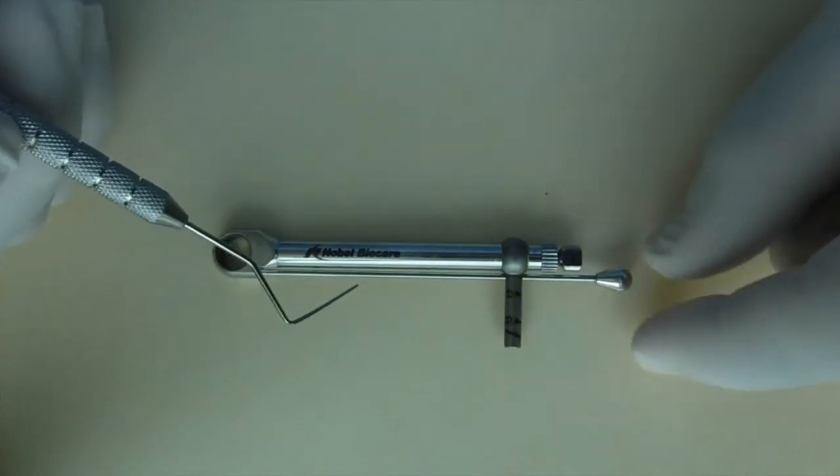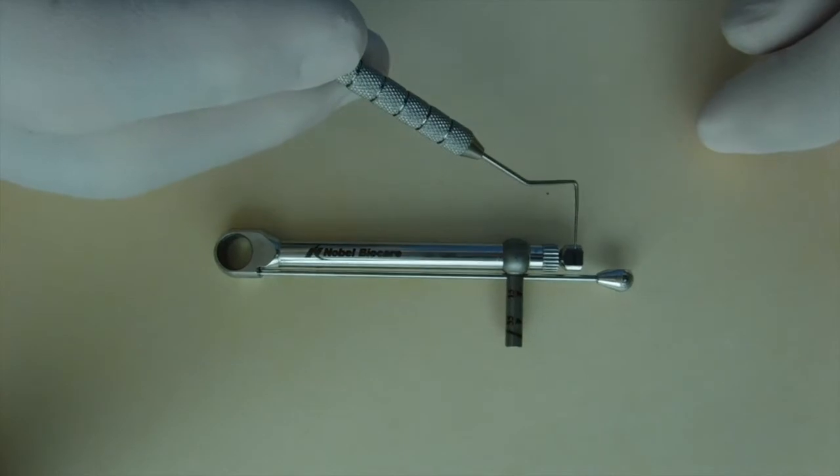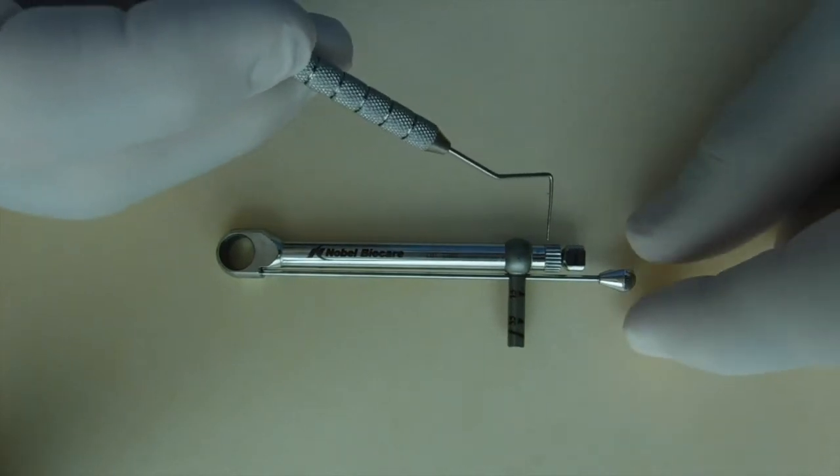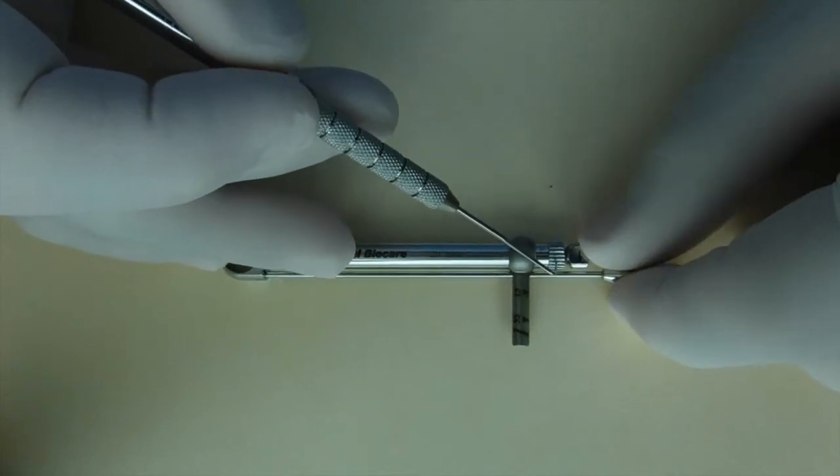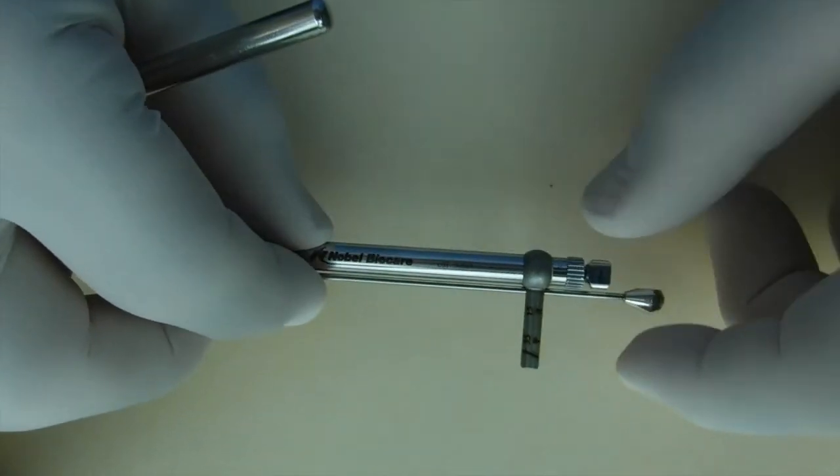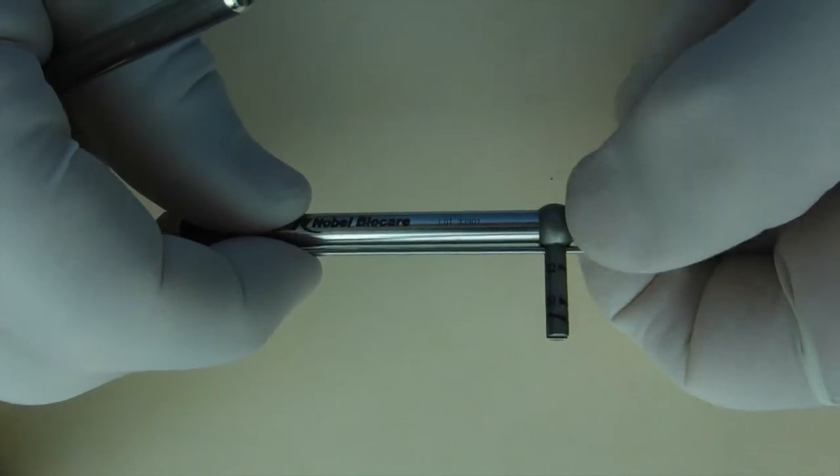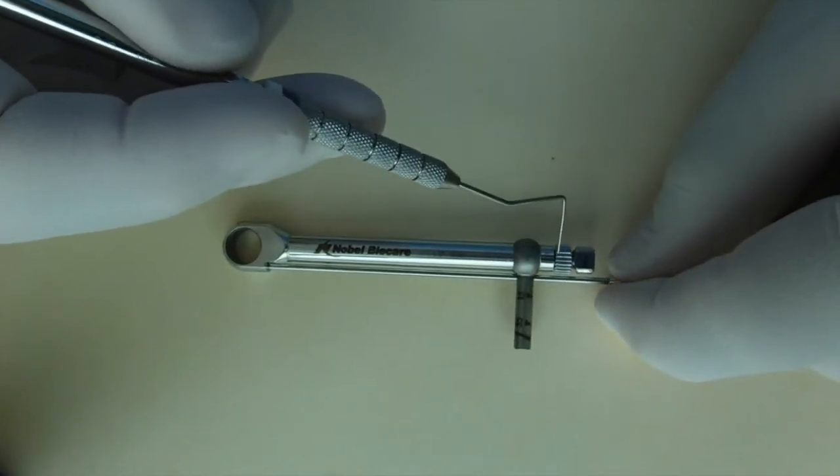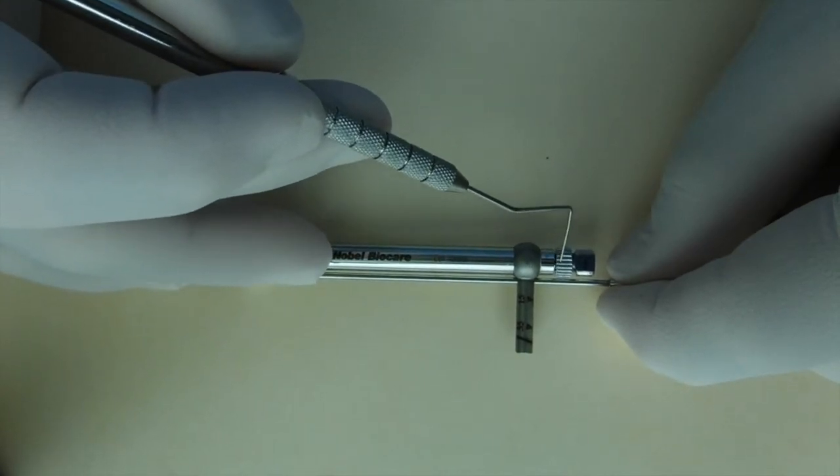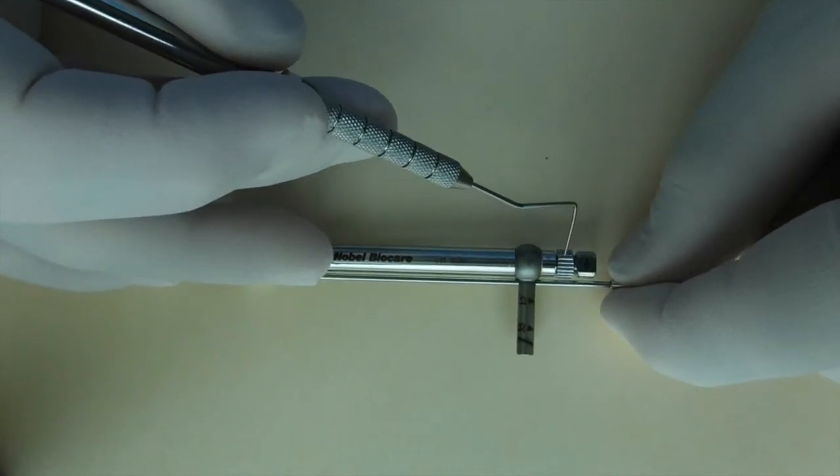You'll also notice next to the arrow indicator is a small gear which can be adjusted, and it can be loosened and it can be tightened.